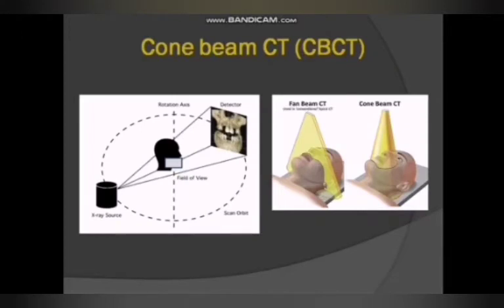Cone beam CT or CBCT is a variation of the traditional computed tomography CT system. It's one of the latest revolutionary cutting-edge technologies in dental and maxillofacial imaging. CBCT utilizes a single cone-shaped X-ray beam directed toward the patient's head, instead of a fan-shaped X-ray beam as used in a traditional medical CT.